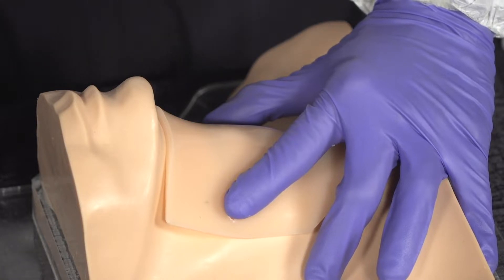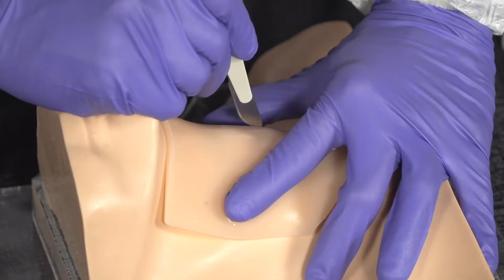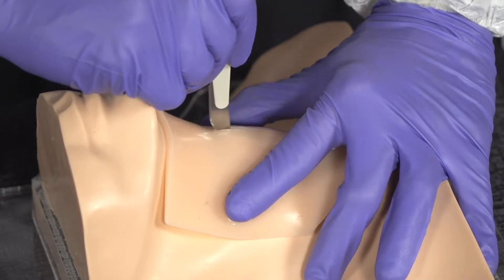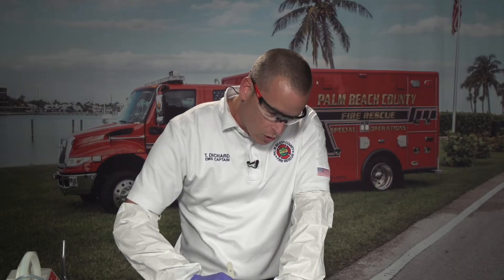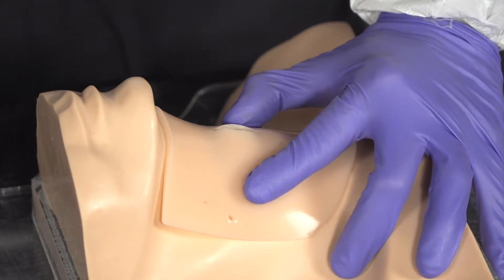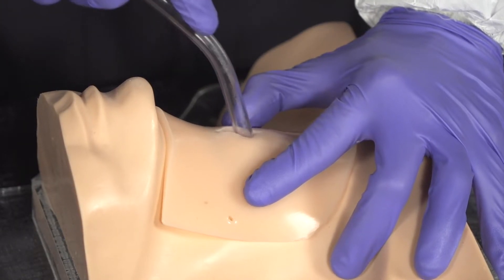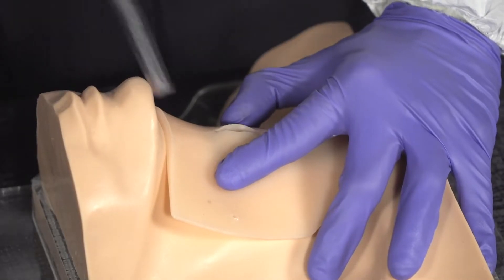Take your scalpel in your dominant hand and make a series of vertical incisions until you've punctured through the cricothyroid membrane. Once you do this, anticipate some bleeding. Secure your scalpel, and with your assistant ready, maintain aggressive and continuous suctioning throughout the skill to help clear secretions.